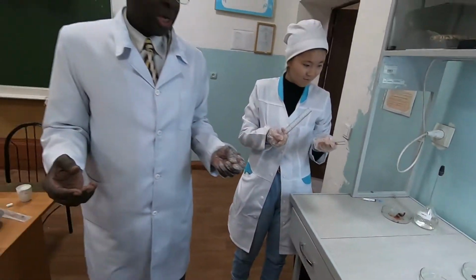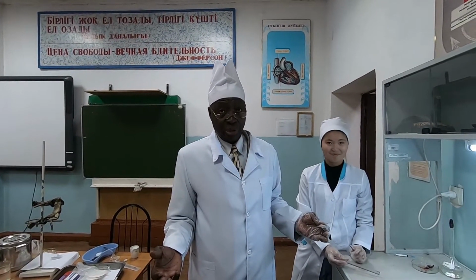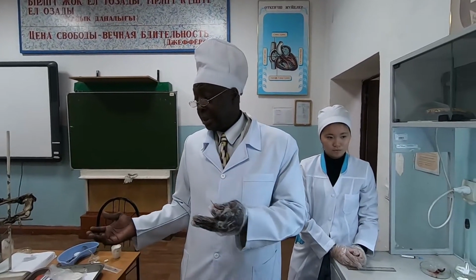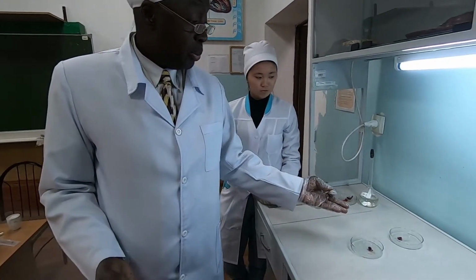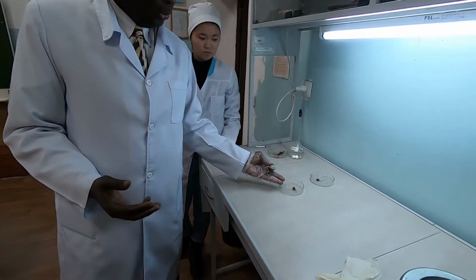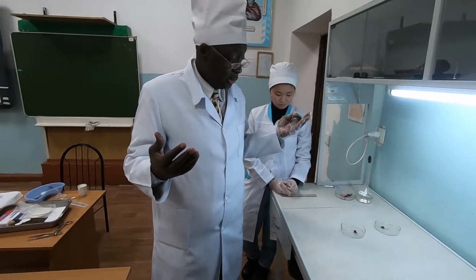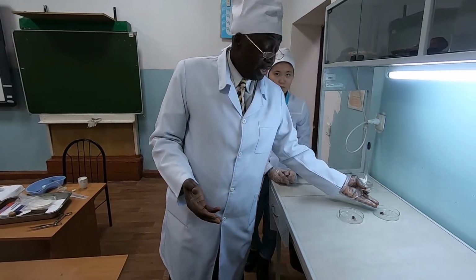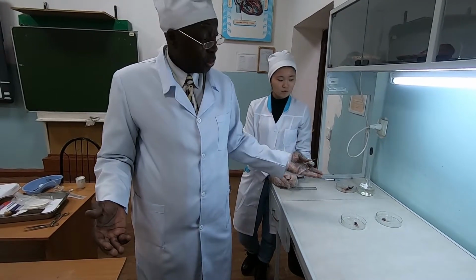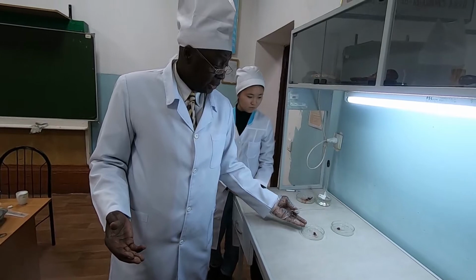All right. So, dear students, we had a very interesting topic today. That's the effect of adrenaline and the effect of Ringer on the eyeballs of a frog. When we apply adrenaline, you see the eyeball widens. That's the effect of adrenaline, and you can read more on adrenaline. And here we have Ringer. It doesn't have any effect at all. This is what we call the control, and this is the experimental.